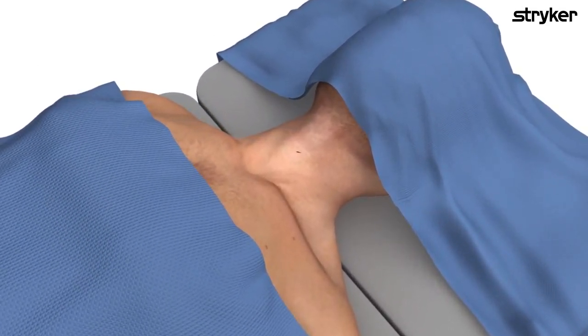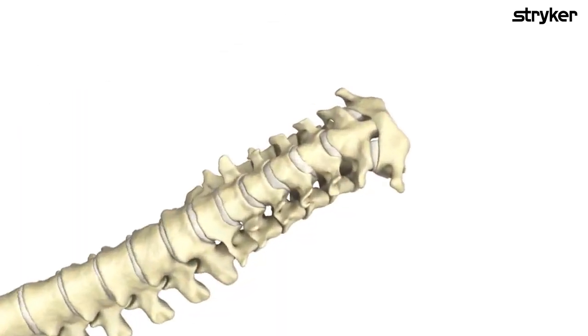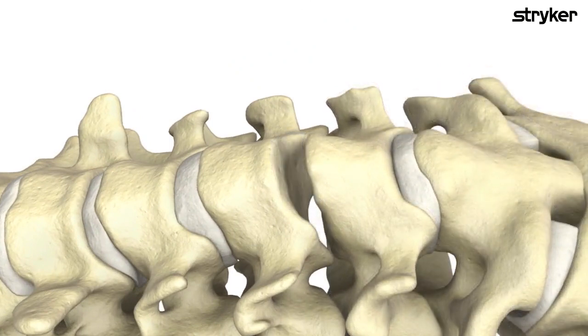Perform a standard incision to expose the anterior cervical spine. Then complete a standard discectomy. Removal of the superficial layers of cartilaginous end plates results in exposure of bleeding bone.